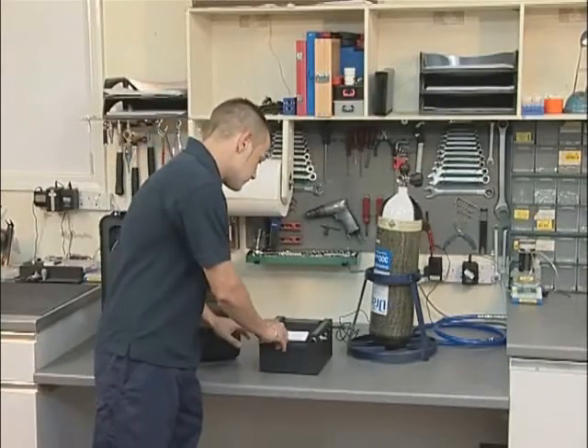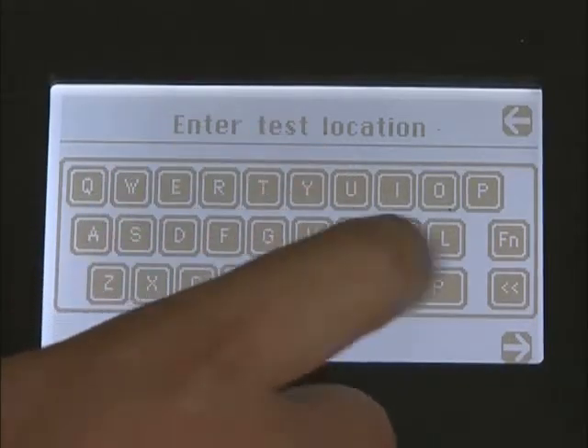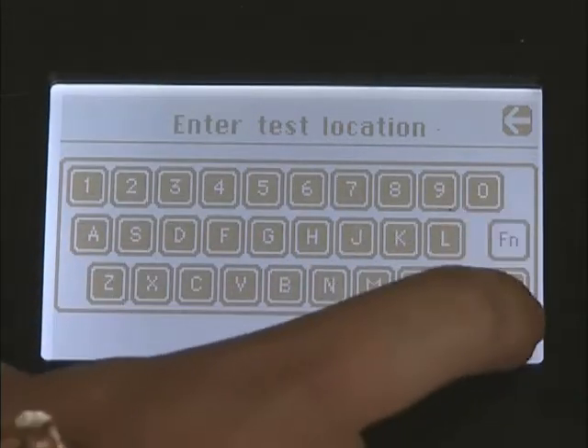You now have the option of entering a description for the cylinder reference or test location. If you wish to use numbers, press the function button. Push the right arrow button when you are ready to proceed.